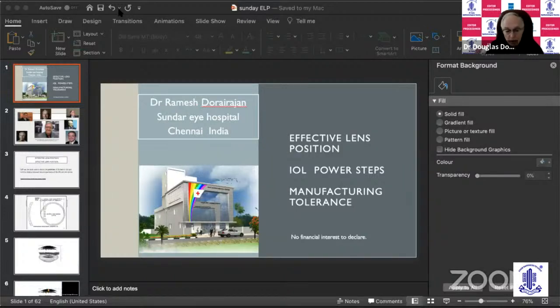You can use the manufacturers' calculators like Johnson & Johnson and Alcon, but those require you to enter data again into another website or web page, and that has a risk of introducing error and takes time. So I would use those that are built into your biometer and with the IOL calculation program that you have, and you're going to do fine.